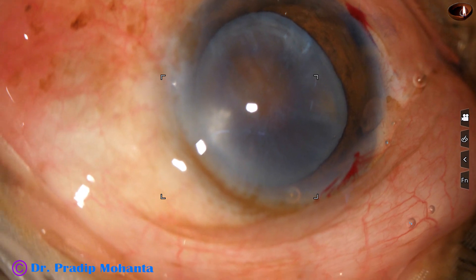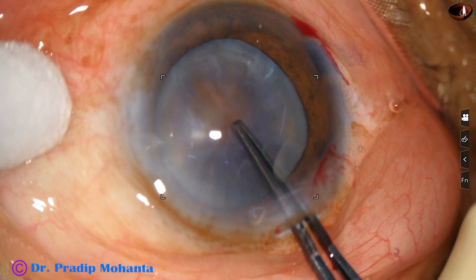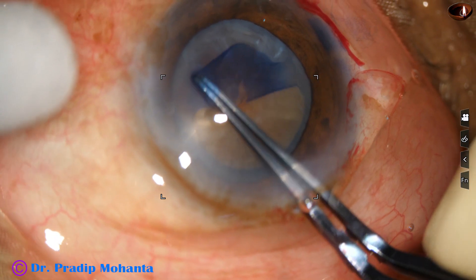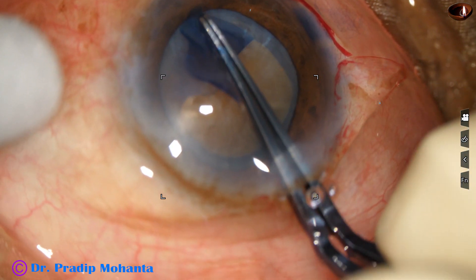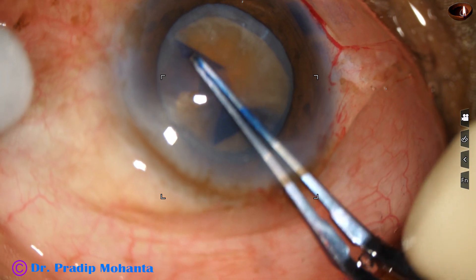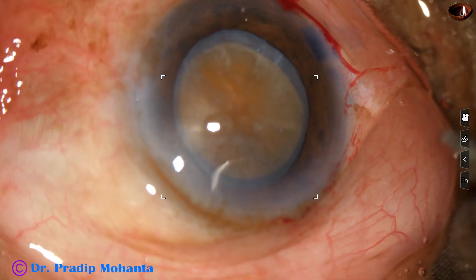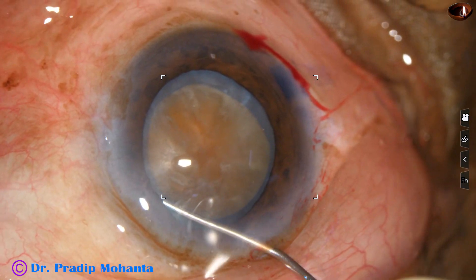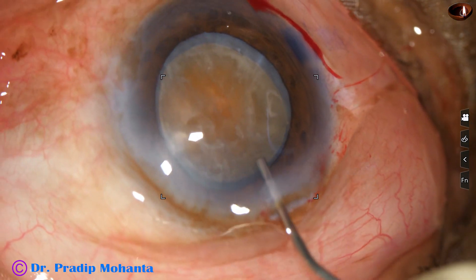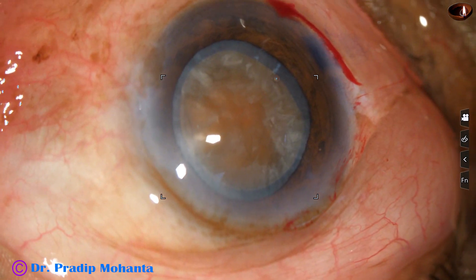Because of peribulbar block, the eyeball is tilted to the right side a bit. And this is capsulorhexis with the help of the capsulorhexis forceps. Since the nucleus is quite hard, I am going to do a large rhexis. In hard cataracts, always aim for a 6 mm rhexis or at least 5.5 mm rhexis — stress on the zonule will be much less, prolapsing the fragments and bringing them to the center will be easier, and there are many other advantages to a large rhexis.